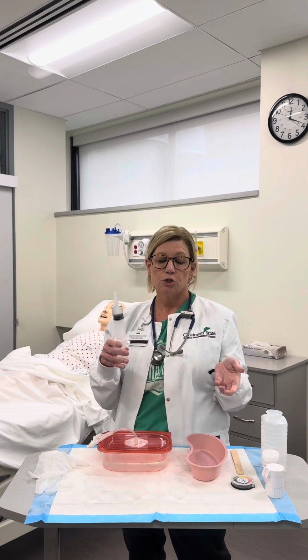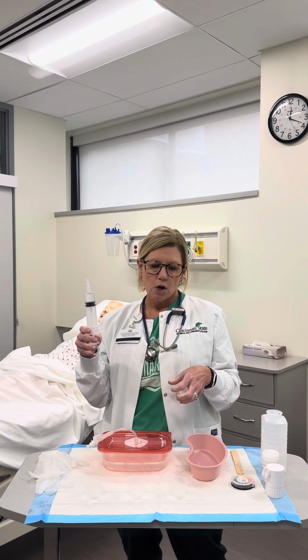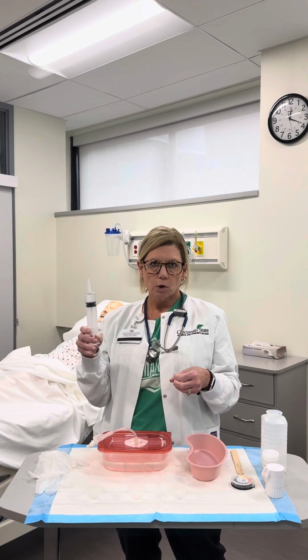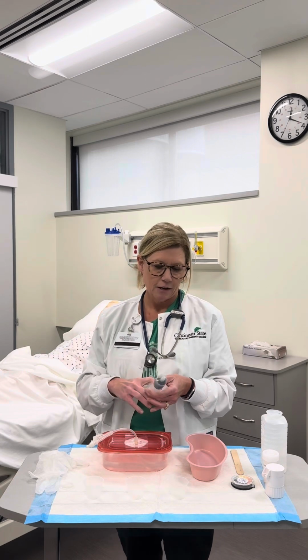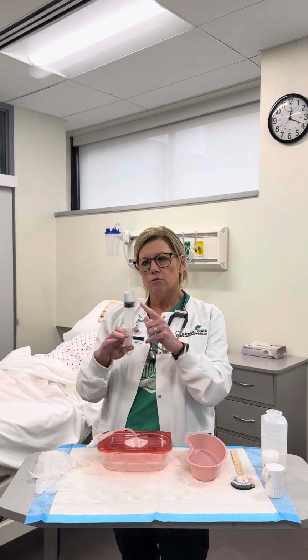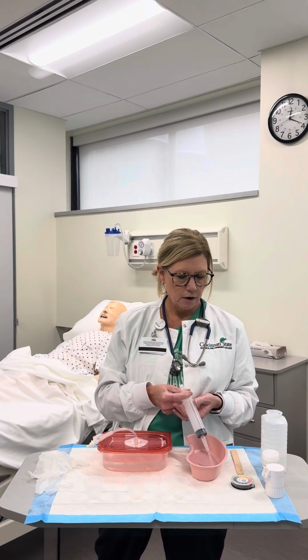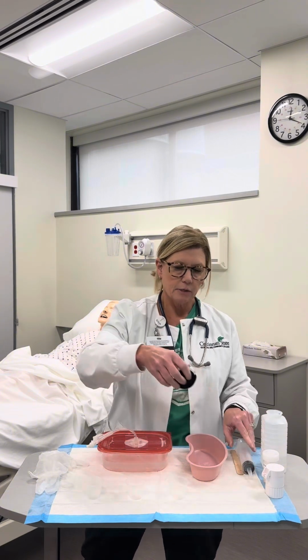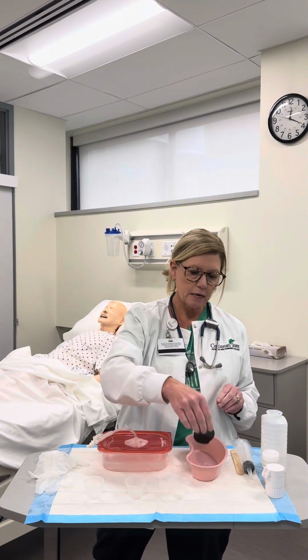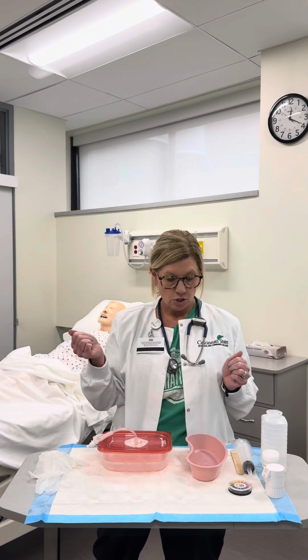And then I do need to check the pH to check for placement. So the pH should be between 0 and 4 because the stomach is very acidic, and I want to make sure that it is in the stomach still. So I've got about 20 milliliters of residual, and we'll say it's kind of a yellow color. I'm going to put the residual here, and then I want to check the pH. So I'll check the pH, and it's 2, so it's good. So it is in the patient's stomach.